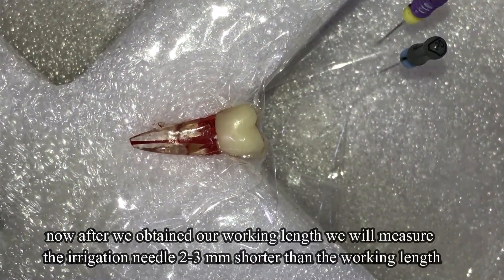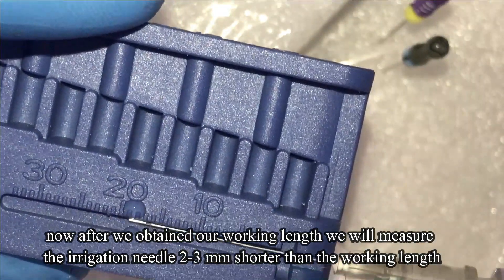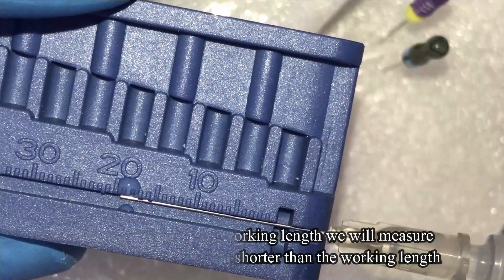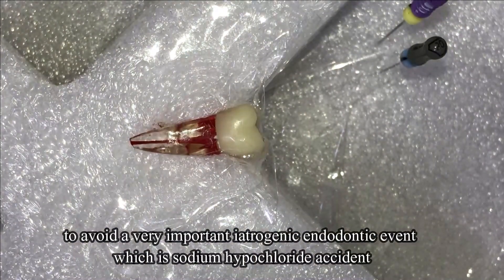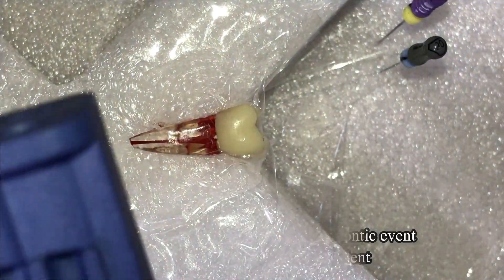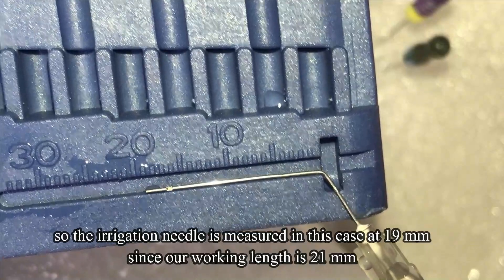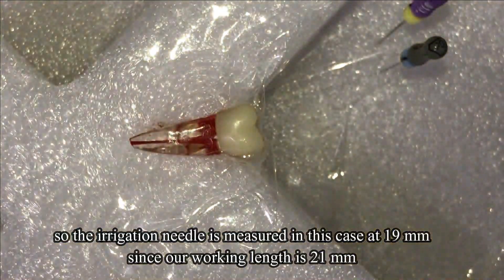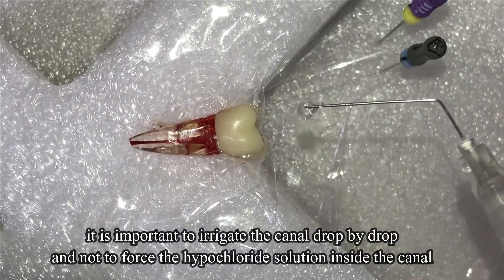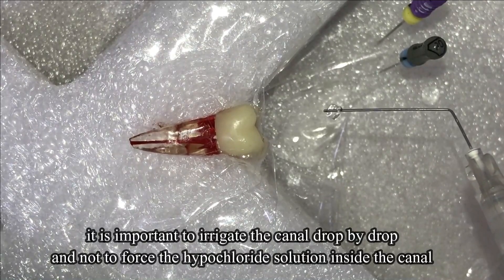After obtaining our working length, we will measure the irrigating needle two to three millimeters shorter than the working length. This is to avoid a very important iatrogenic endodontic event, which is a sodium hypochlorite accident. So the irrigation needle is measured in this case at 19 mm because our working length is 21 mm. It is important to irrigate the canal drop by drop and not to force the hypochlorite solution inside the canal.